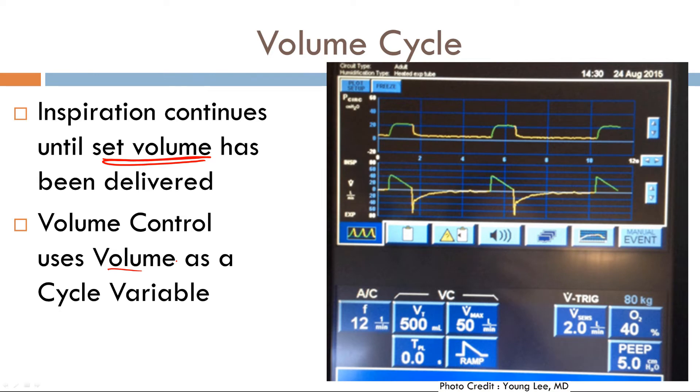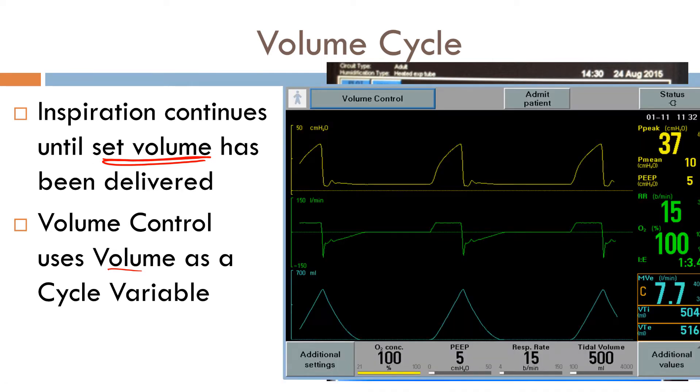So let's take a look here. We have pressure. We have flow here. As you can see, the cycle variable has been set to 500 milliliters. So once 500 cc has been delivered, boom, stops delivering your breath. So let's take a look at this. Here we can see we're in volume control as well. And our cycle variable is here, 500 cc. So once 500 hits here, it stops delivering your breath.